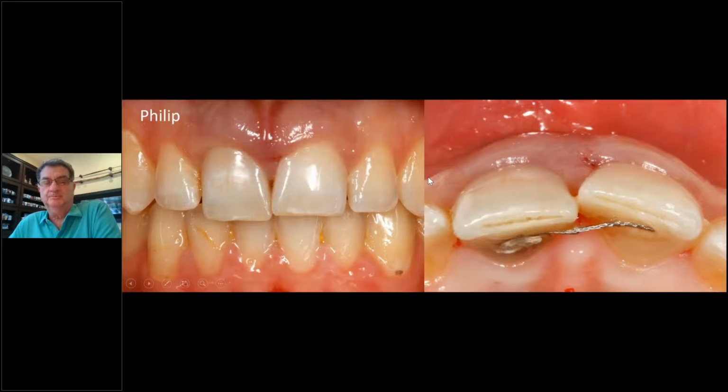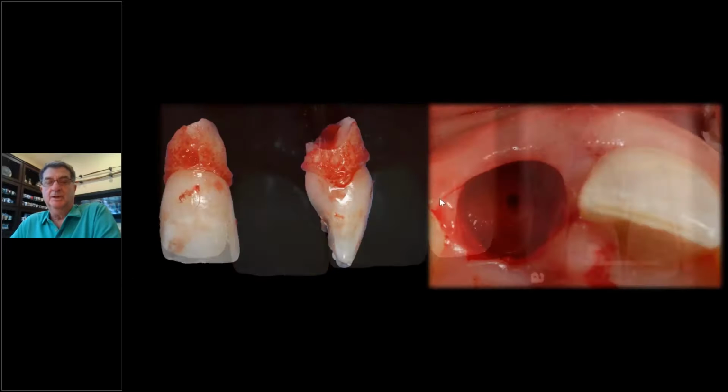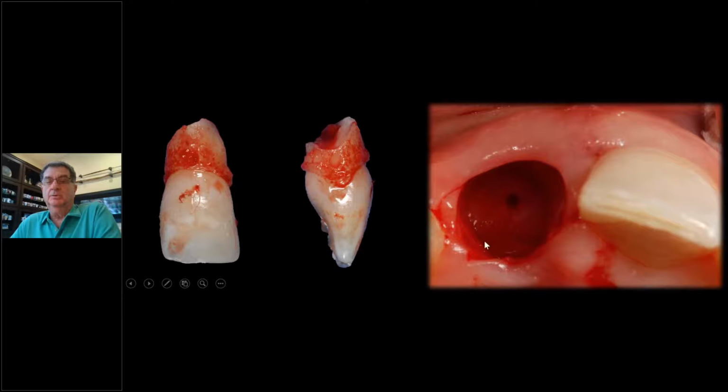So I want you to look at Philip. This is what we started to see. Take a look. Philip has a broken tooth. He was sent over by his dentist for us to fix him. And what you see here is the crack. We're going to take the tooth out. But wait, now I can't take it out, so what am I going to do? The buccal plate's there, but the tooth was fractured. And how do I get it out without a flap? I don't flap. Everything is through the socket. Now, if that opening is not big enough for you, put some loops on.